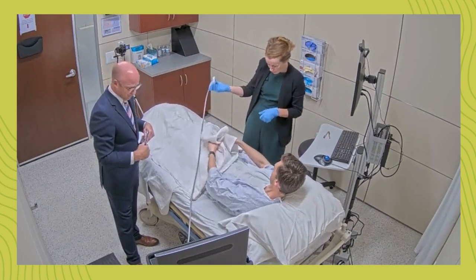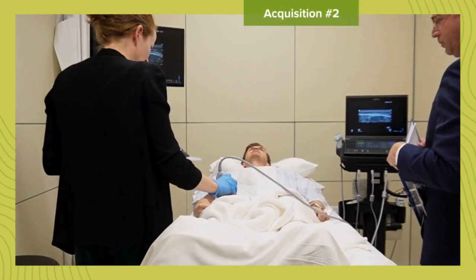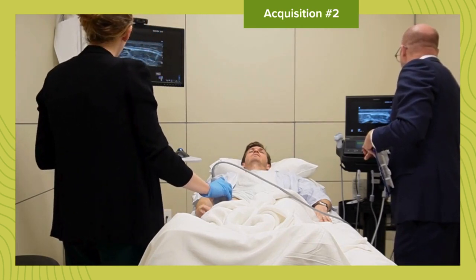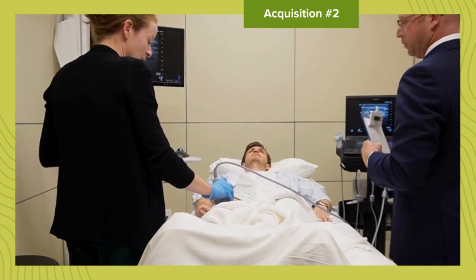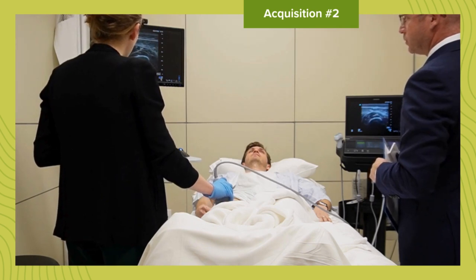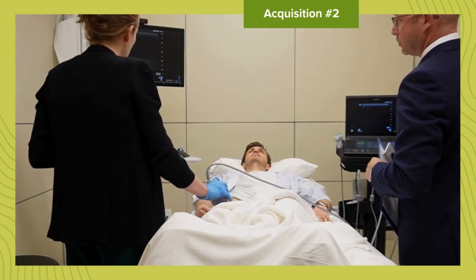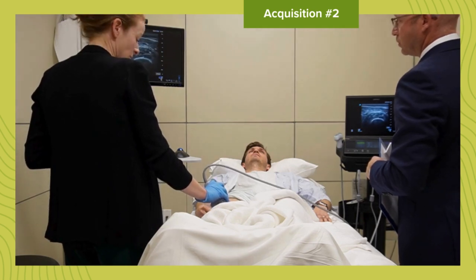Would you mind exposing your right thigh for me? Thank you. Cold jelly. Ow! That hurt! I'm sorry, I'll try to be a little more gentle. Thanks for letting me know. Would you mind increasing the depth to five centimeters? That's perfect, thank you. I'm using my linear probe in the transverse orientation, the indicator pointing to the patient's right, and I would be scanning through the affected area on the right thigh. I would be looking for any signs of a soft tissue infection, like cobblestoning suggestive of cellulitis, or a fluid collection consistent with an abscess. I think that would be my image.